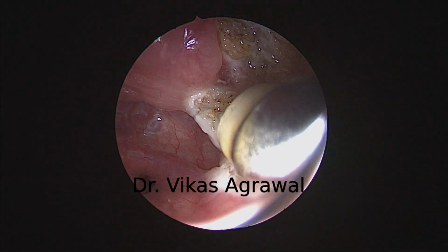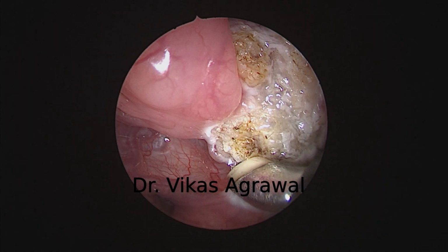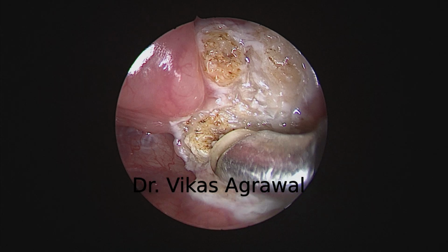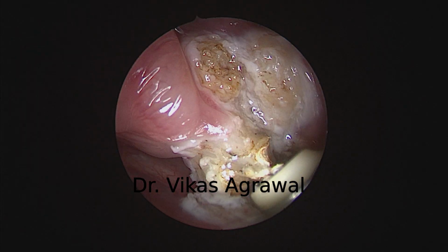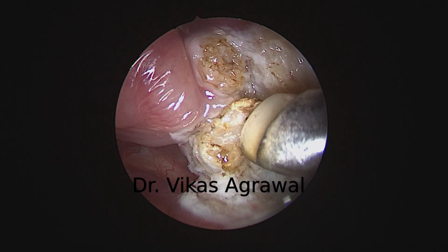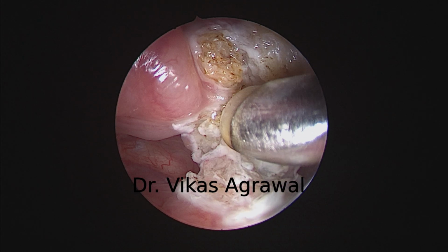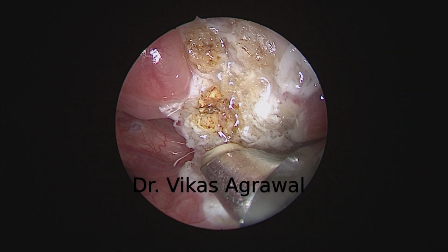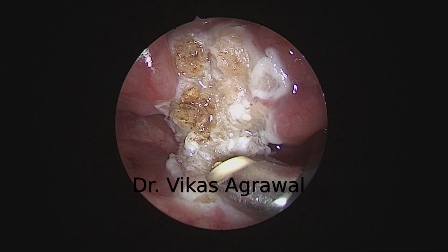So let me first coagulate it, and then remove this extra bit of lymphoid tissue by ablation. Alright. The lymphoid tissue is ablated, but I am only coagulating the median glossoepiglottic ligament.